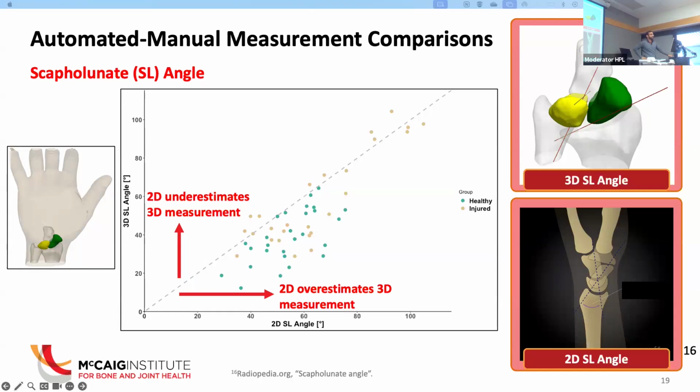Would you say it's more reliable? Yeah, it's more reliable, more reproducible. If I were to do those 2D measurements, there's going to be variability between the people taking those readings. So the fact that we can have an automated method that automatically gets those measurements is definitely one of the big benefits of this automated pipeline. We have a question from Benno.